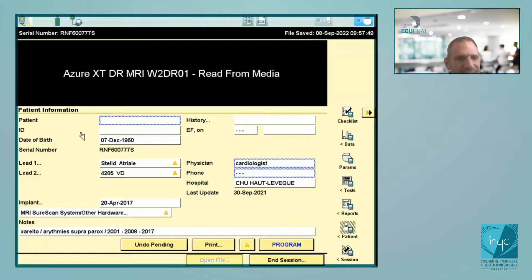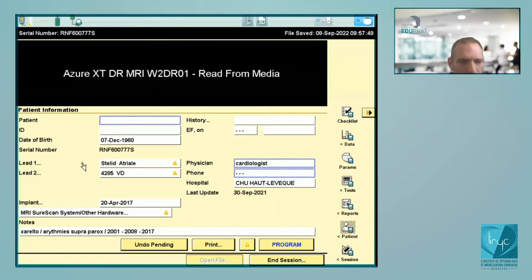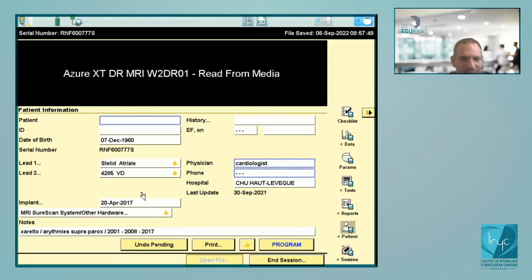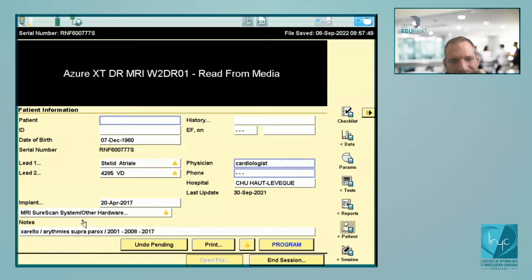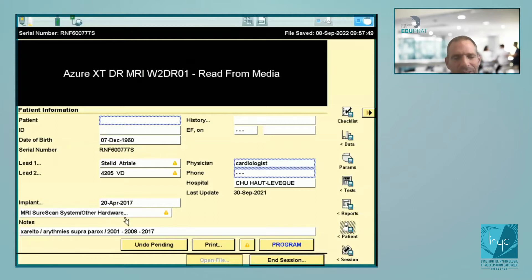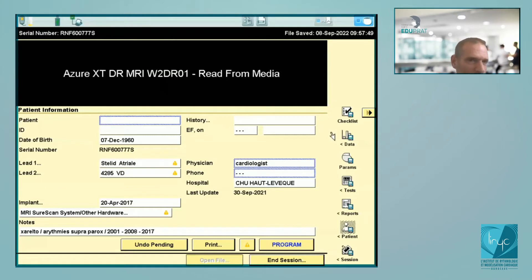You'll see the main information here — it's important when you do an implantation that you specify all this information. You'll see the leads, which kind of leads, and whether it is unipolar or bipolar. You'll see the time of implant — for example here it was implanted in 2017. Sometimes it's important to specify special notes; in this patient it's written that he has episodes of supraventricular tachycardia and receives Xarelto, an anticoagulant for atrial fibrillation. The very first device was implanted in 2001, with a change of box in 2008, and the last one in 2017.